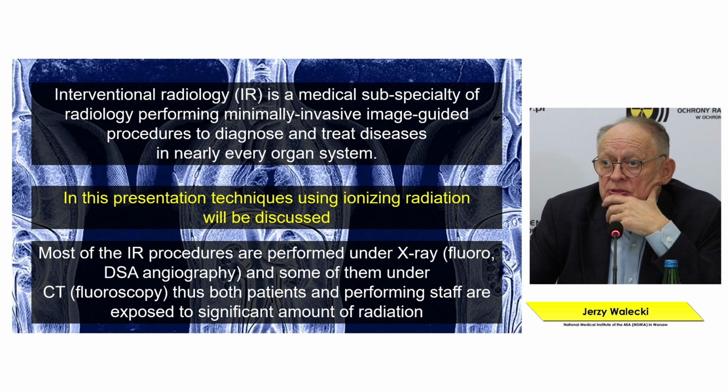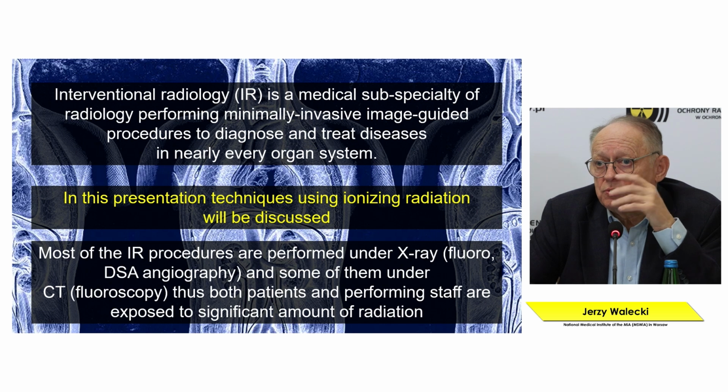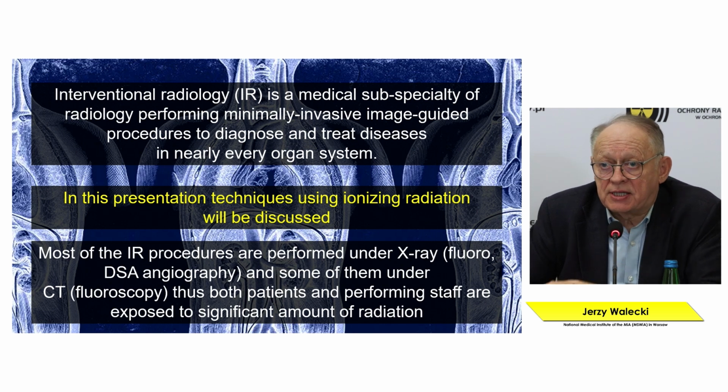There are many procedures of interventional radiology that are performed using X-ray, fluoro, DSA, angiography, but also computed tomography with fluoroscopy.